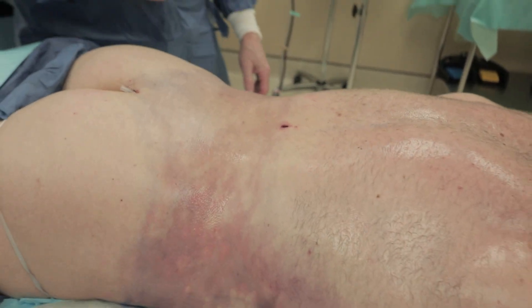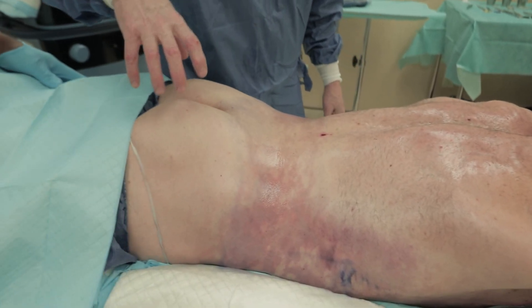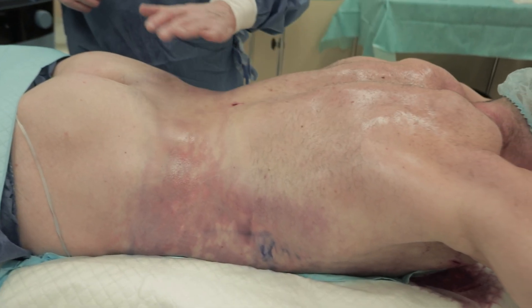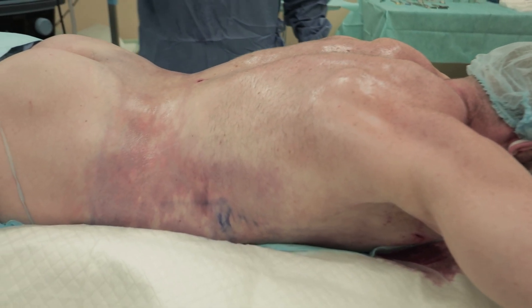But look what I did — I scoped it 360, gave him that Christmas tree. Look. Now do a Superman, tighten up your butt. Look at that great volume there, the great gluteus maximus, gluteus medius up and lateral. And that Christmas tree — look — the paraspinal muscles, and all the way to the lats, which continue to the front end.